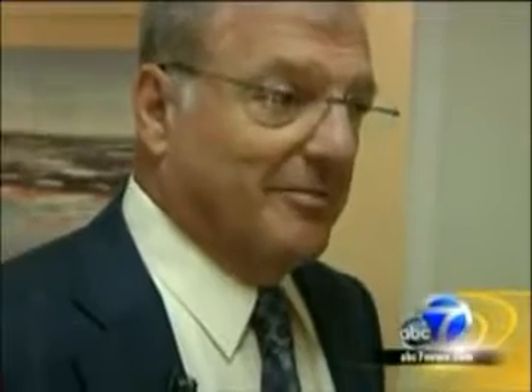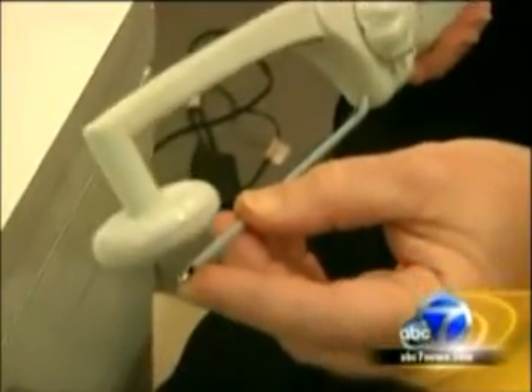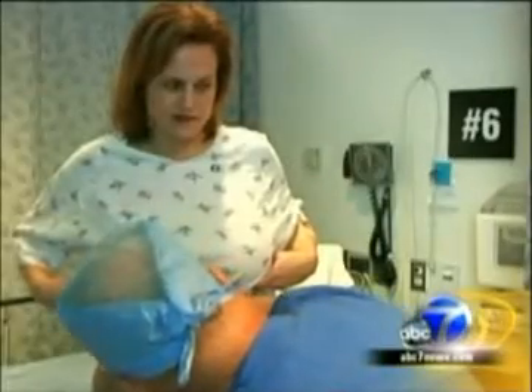So Diana turned to Dr. Howard Rosenberg, who's testing a new device called BodyTite. It combines a traditional liposuction wand with a tip that uses radiofrequency to produce heat. Using both liposuction and radiofrequency waves beneath the skin, it coagulates blood vessels, it liquefies the fat, and it also remarkably shrinks the skin.